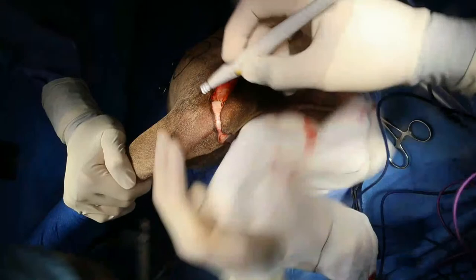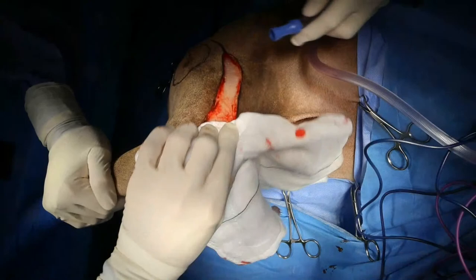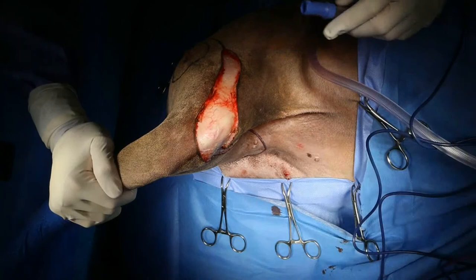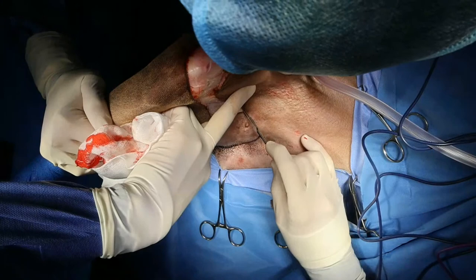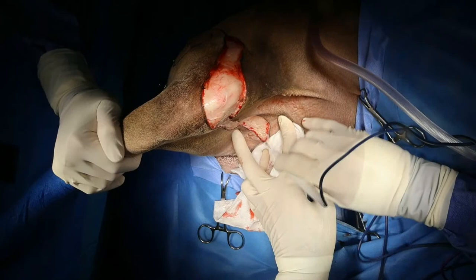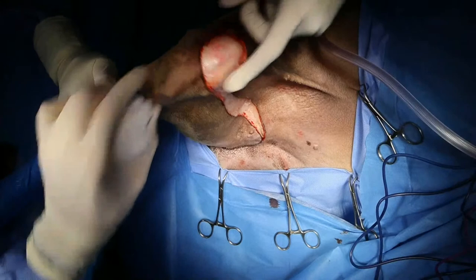And so the name of that vessel, see if anybody has gotten it. The name of that vessel is the geniculate artery. And that's a great axial pattern flap, very consistent and reliable. Good for defects that are in the distal limb, distal to the stifle. So hopefully you guys can see what I'm doing there. Just coming around the groin here.